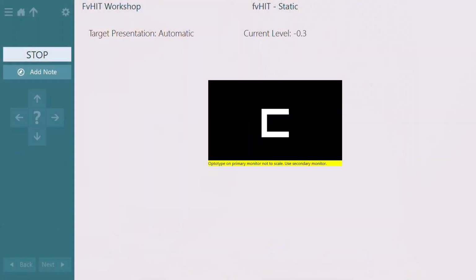So like DVA and GST, the patient will see an optotype, a letter that's displayed in front of them that will appear during the head impulse movement. This is done passively by the clinician. As they recognize that optotype during the head impulse, that then gets scored in the system as a correct, or if they don't recognize it, an incorrect response.